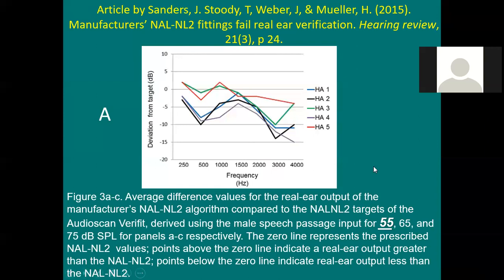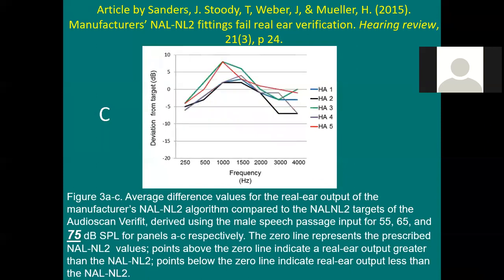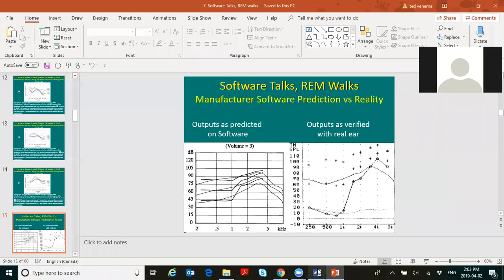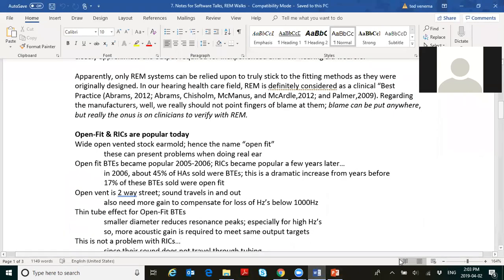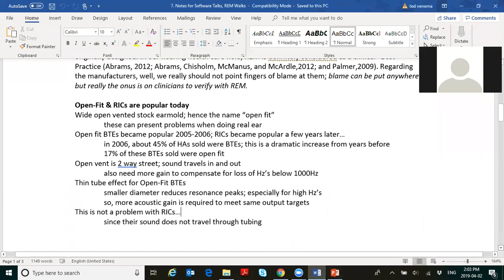I think this is one of the better articles, especially for emerging students, to take a look at really carefully and read it. It's a great article. Software talks, Real Ear measurement walks. Totally different situations. If we go now to what we saw here on our notes, we'll scroll down the page and look at a little bit of open fit and RIC hearing aids, receiver in canal hearing aids.